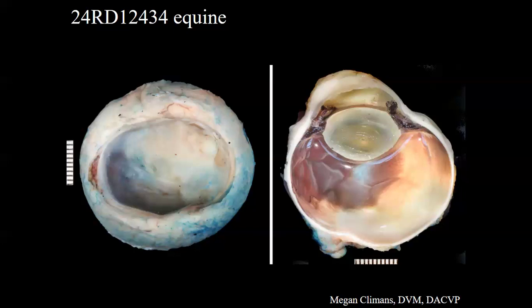The anterior chamber is formed and clear. Pretty much everything else in the eye is described as normal clinically. Corneal mass. So we have the front and undissected view of the eye here on the left, and then the hemisected view on the right. And you can see this markedly thickened and opaque tan cornea, just as they said in their description. Also in this case, I'm going to point out back here in the fundus, there is this unusual, almost wavy pigmented line, or patchy pigmentation in the fundus, which is a little unusual, and we'll revisit that in a second.